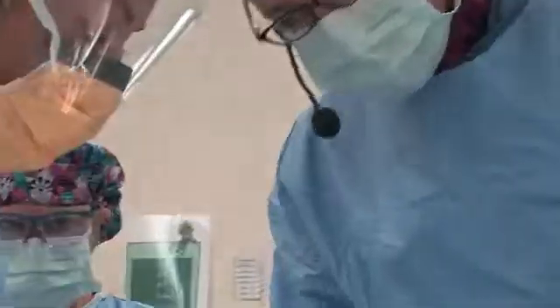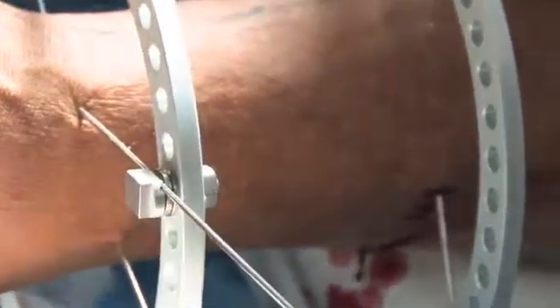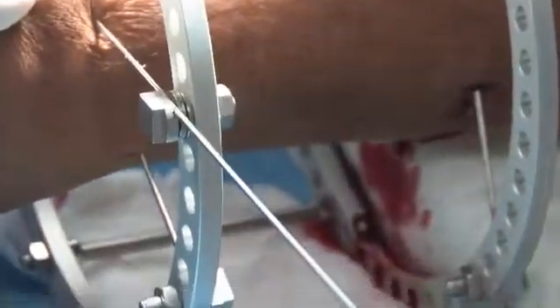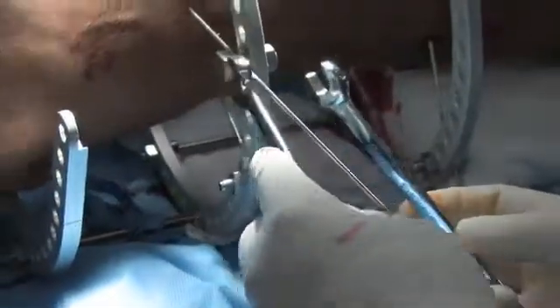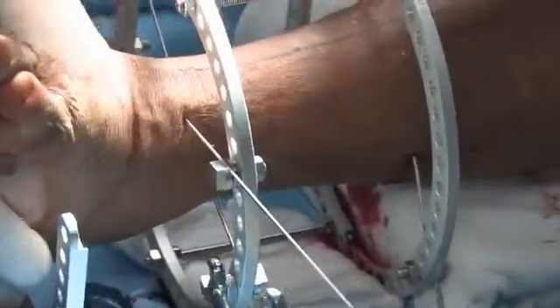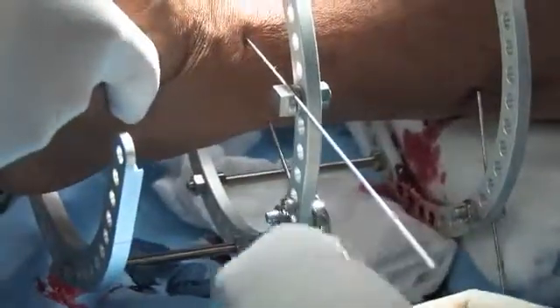There we go. Now at this point, these olive wires are color coded. The olive side has black stripes on them. We'll go ahead and tighten up our olive sides, and then we'll start tensioning our non-olive sides. May I have 2 wrenches, please? Yes, tighten the olive side. When you tighten these, you just want to be cautious that you're not going to bend the wire.